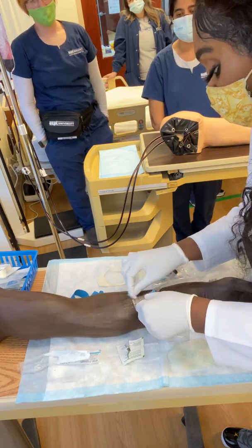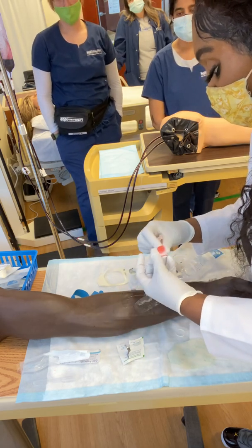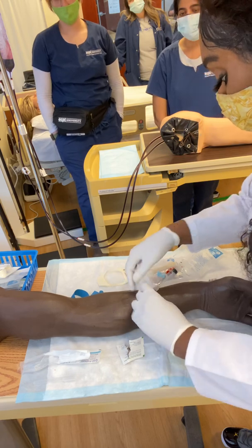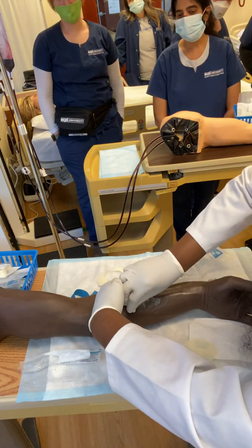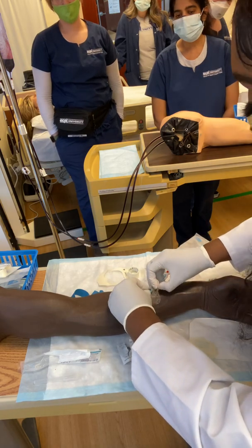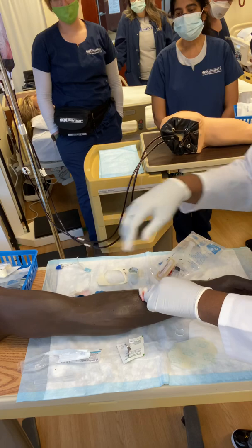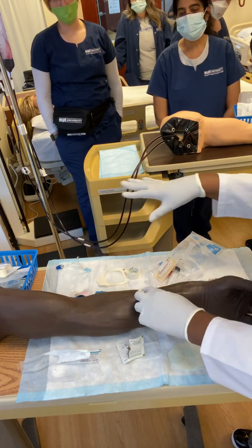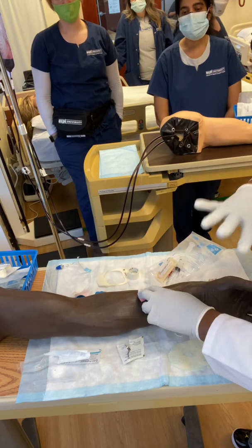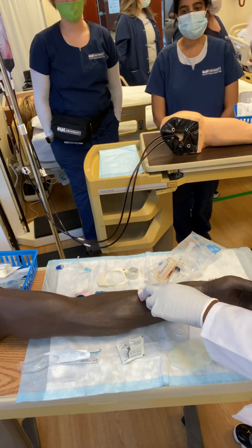Just like that. Okay? And as you lift up, just be careful. You're just going to use that gauze and apply it right there, and we're going to keep using that alcohol to pull away. And then we just remove. And then, of course, we'll tape it. And then we're going to assess for any type of adverse reactions, any swelling, redness, anything like that. Okay? That's it. Now I'm really done.